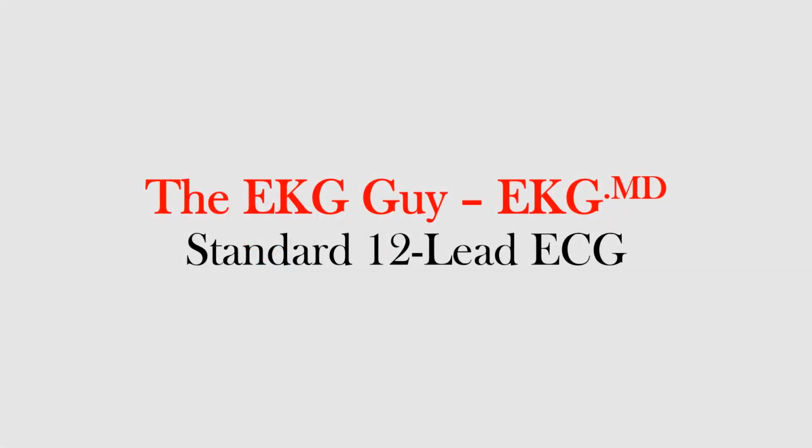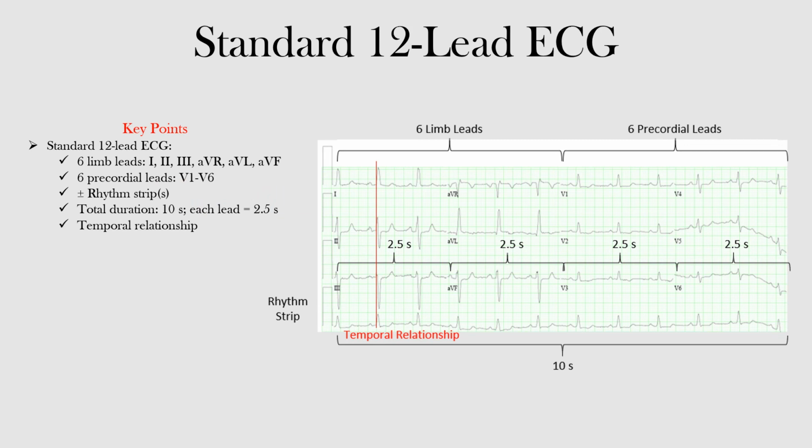In this lecture, we will discuss the standard 12-lead ECG, including its basic layout and the temporal relationship of leads to one another. The electrocardiogram represents a three-dimensional image of the heart's electrical conduction system. As its name implies, the standard 12-lead EKG is broken down into 12 leads or views of the heart. It consists of 6 limb leads and 6 precordial leads.